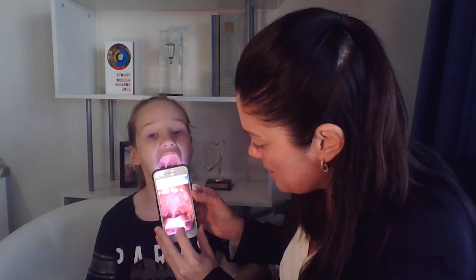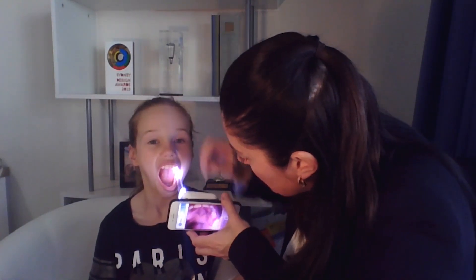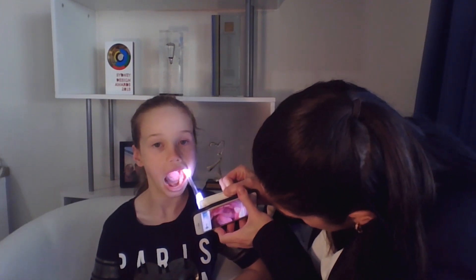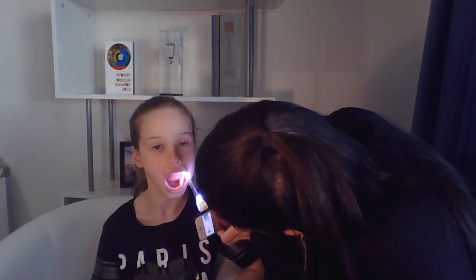I'll capture a couple of images so I can show you how you can use it to measure. And then what you can do is retract the side of the cheek as well to get a really good image of the back molars. I'm just going to slide it down here, and you can see that we can go up and into the cheek and capture images of the top of the mouth and also the bottom of her teeth.